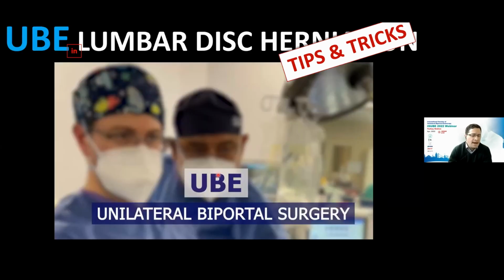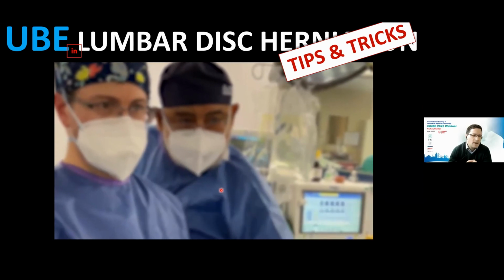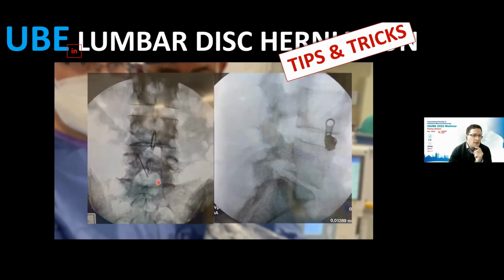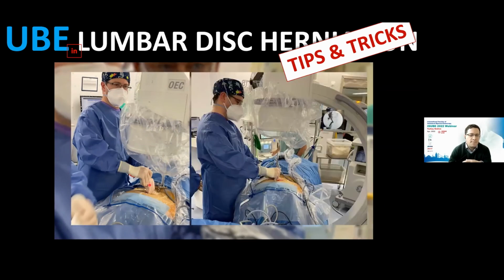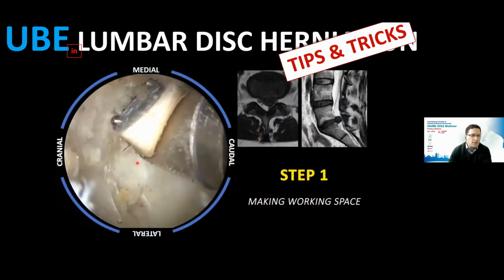This is an example, a case of L5S1. We recommend you start with this kind of case. L5S1, a migrated herniation with a wide interlaminar space. We do an AP view, trying to identify where the space is, and start to find it. 5-minute rule, remember the spinolaminar angle.